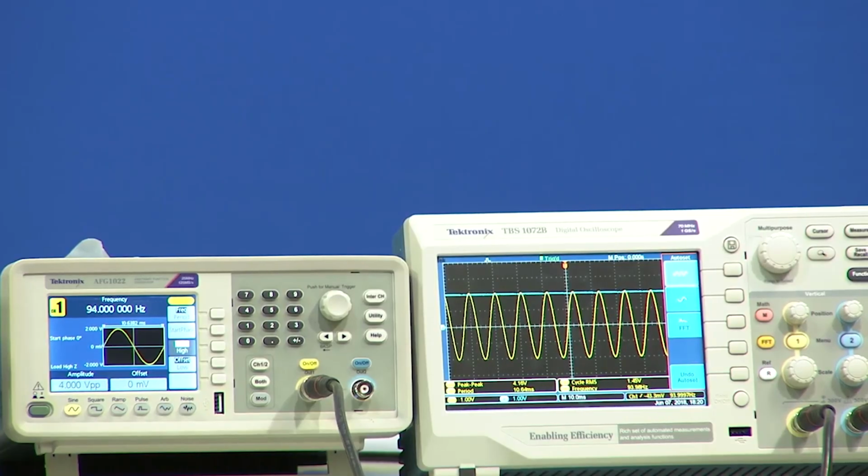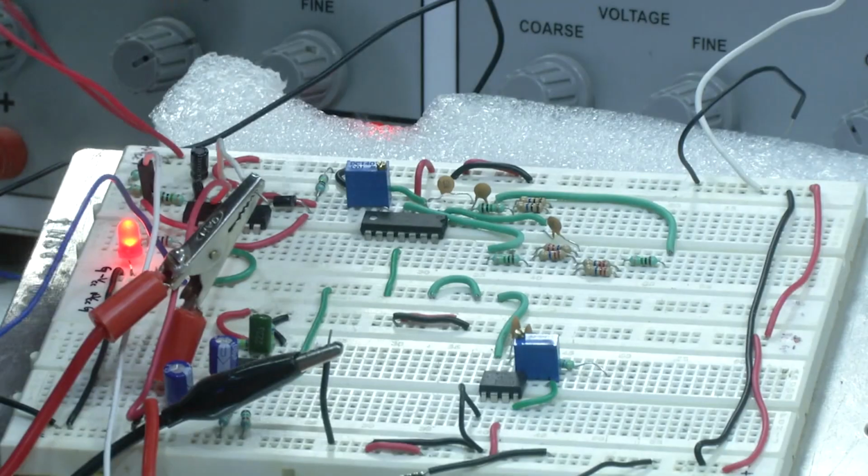Then the next part is, once the peak detection is done, we have to create a threshold. Now if we recall our circuit, we are creating the threshold by using 2 resistances, that is of 1 mega and 2 mega resistor. Why we are using such a high resistance value? Again the reason is to not have any loading effect on the system. So what I will do is, this particular output terminal, the blue connection, I will connect it to the junction, the resistor junction.